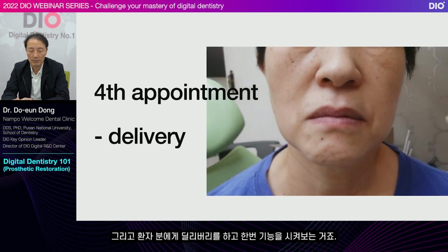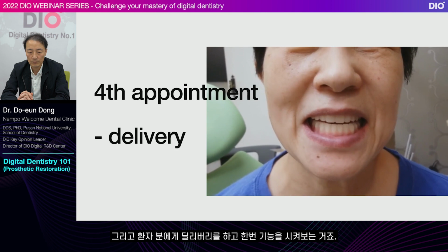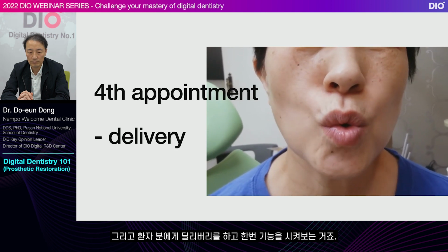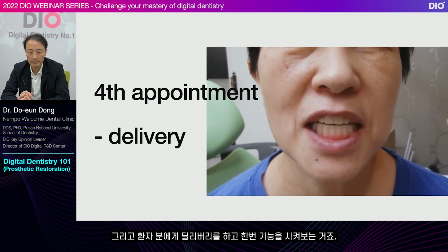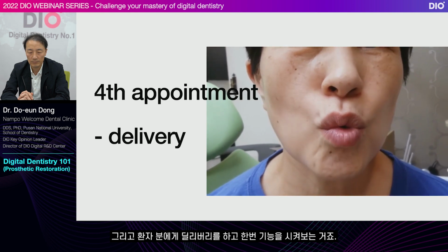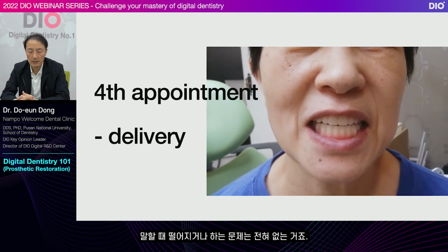You deliver it to the patient and check the function. The dentures will have less chance of falling off when talking.